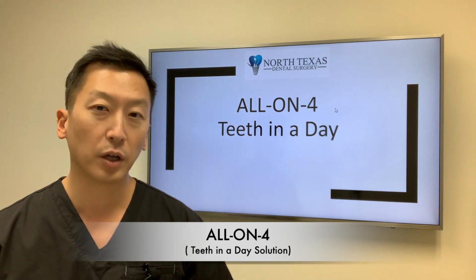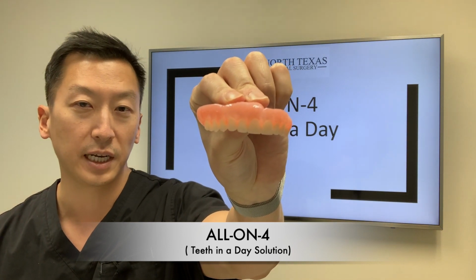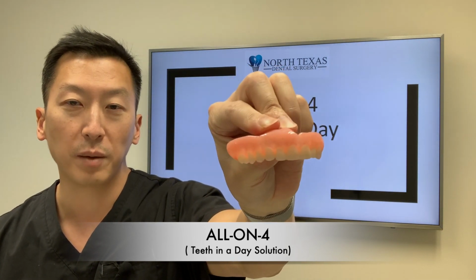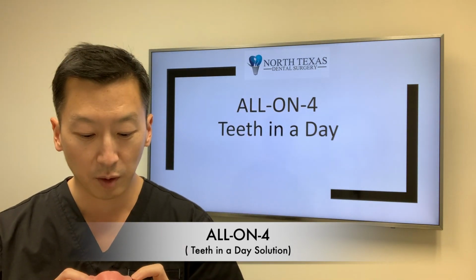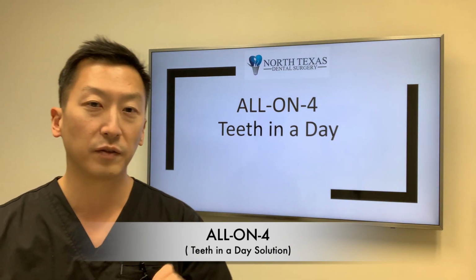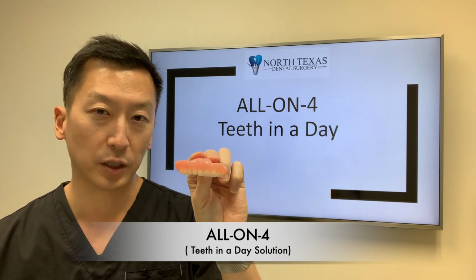So traditionally, we all know people, maybe your grandmother, relatives, or friends, somebody who has a complete denture. A complete denture is a prosthesis made of plastic or acrylic that is just shaped and colored to look like gums and teeth. Although it may be a great looking solution, patients really are unsatisfied with its retention in the mouth and its stability when chewing or talking. That's why a lot of patients use a lot of denture glue or other solutions, but in all practicality, it's not the greatest solution for replacing your own natural teeth.